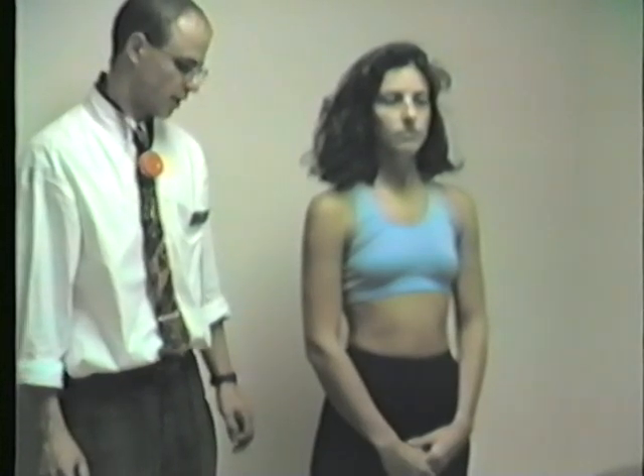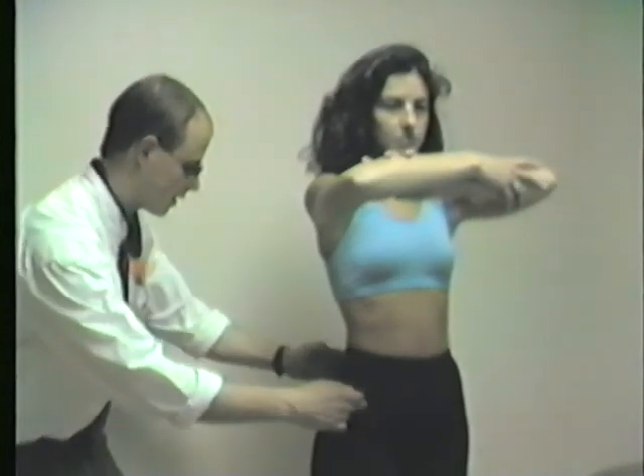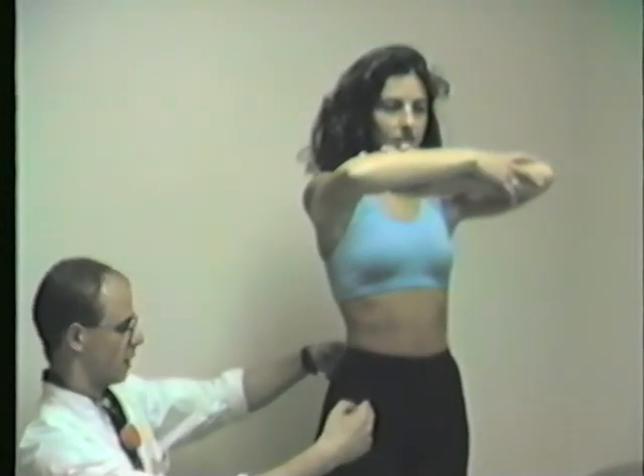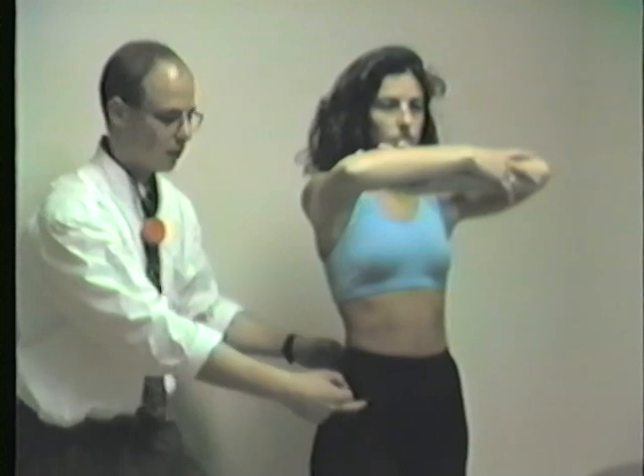Next I'm going to demonstrate how to measure pelvic alignment — anterior iliac rotation — the way it is statically aligned as well as the range of motion through anterior and posterior pelvic tilt. That was actually the reason why I invented the tool to start with, because I learned the standard evaluation technique of just palpating the ASIS and the PSIS, and then imagining the line between my fingers and trying to estimate what the inclination is. With those little deviations that occur, that was just too inaccurate. That's why I came about doing this whole thing.